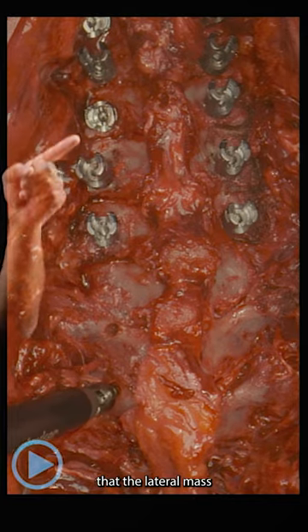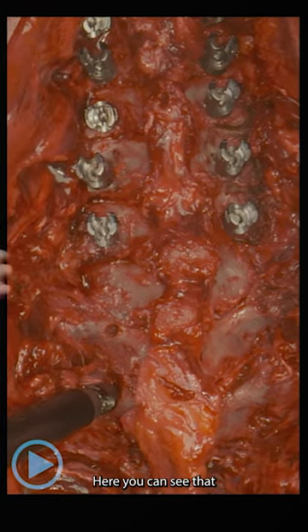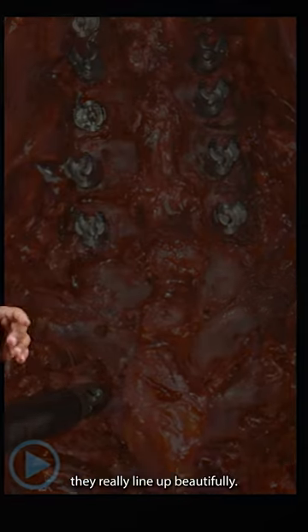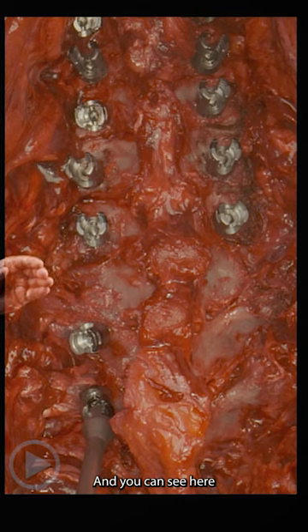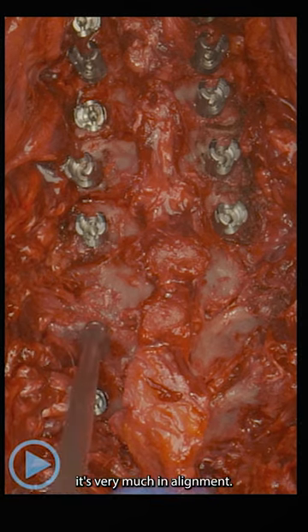Here you can see that the lateral mass screws line up and they look pretty good. You can see that the thoracic pedicle screws, by putting a bit of thought into the start point, they really line up beautifully. Just with the alignment afterwards, everything looks like it's very much in alignment.